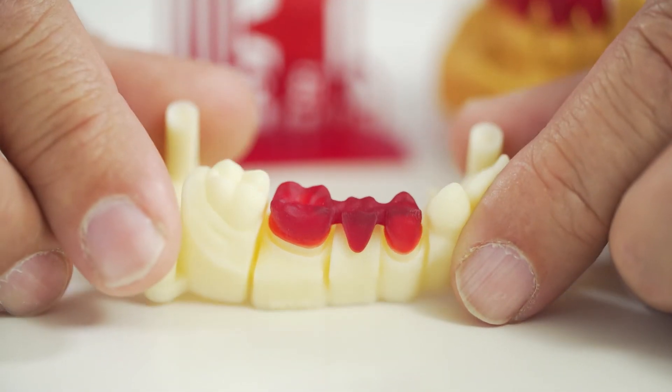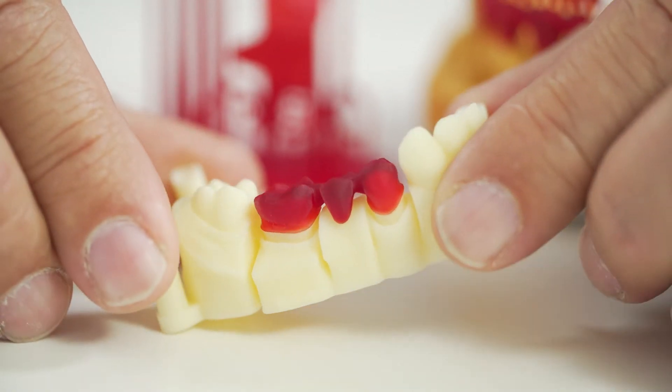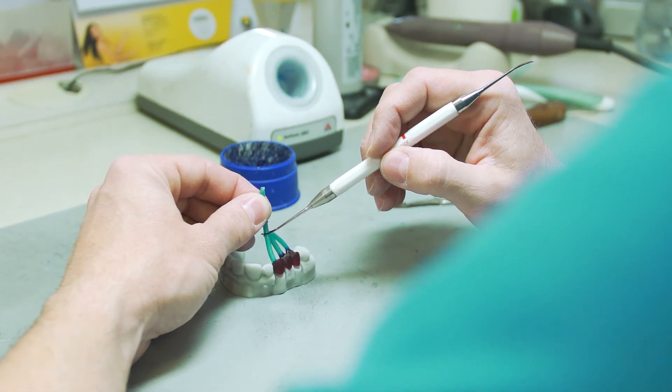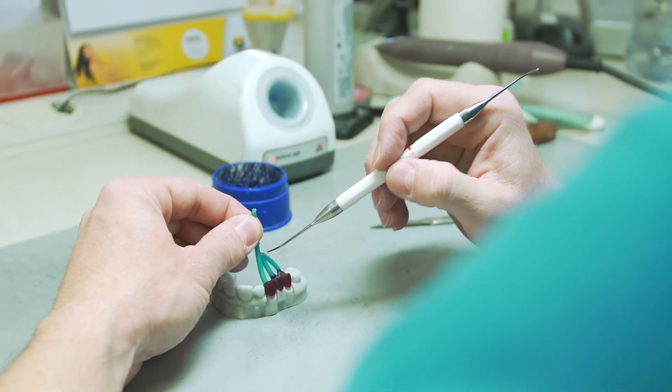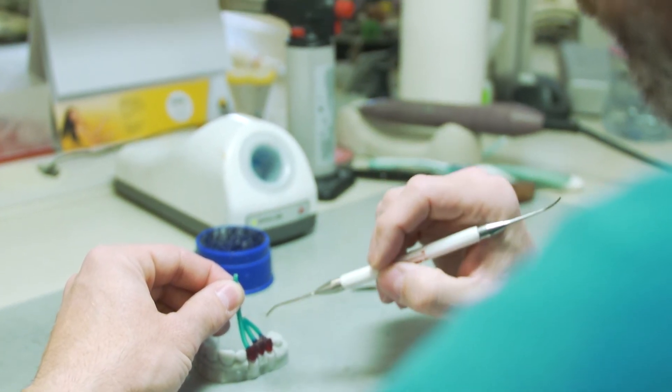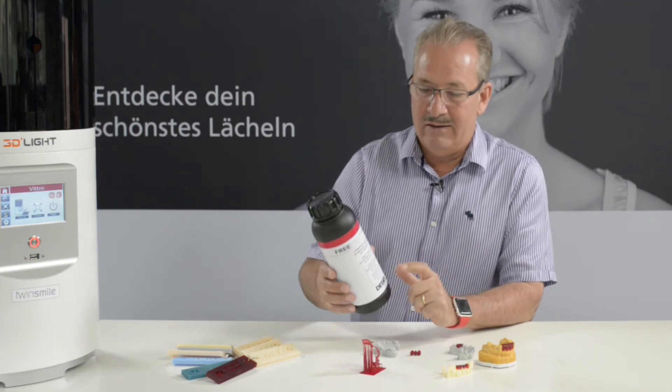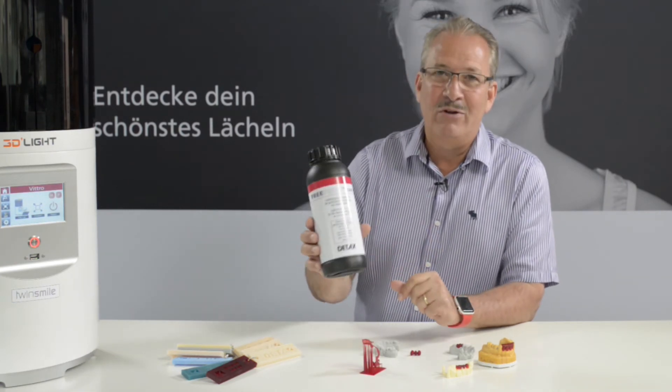When you have milled your parts up till now, you don't really get into the sharp corners. But with printing you get all the details because there is no limitation of any bur diameters. That is why I really recommend that you cast all your parts using a liquid that you print.